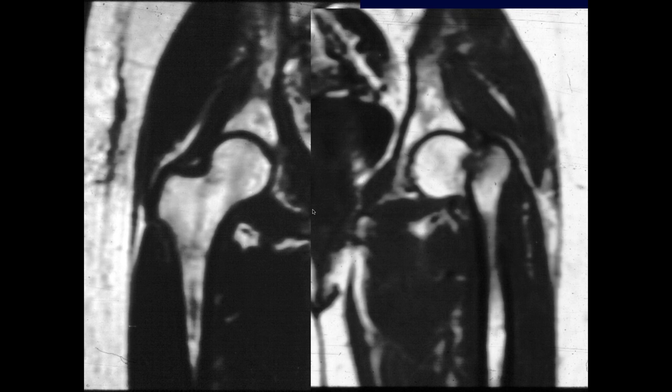And then we got interested, and we went on and did other studies, and we found that we could detect the trabecular edema pattern much earlier than you could with bone scan, CT, or plain films, and recommended that everybody switch to using MR scan to evaluate hip injuries early on. So that's kind of a little history there.